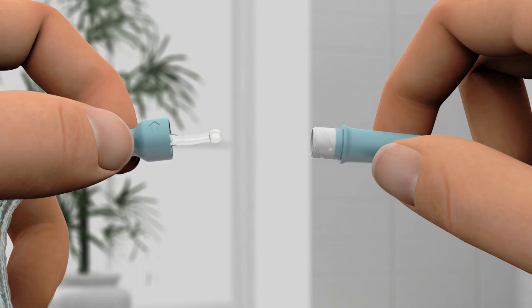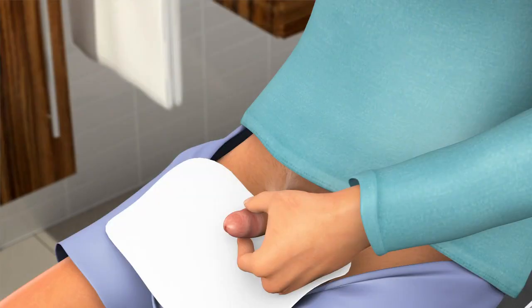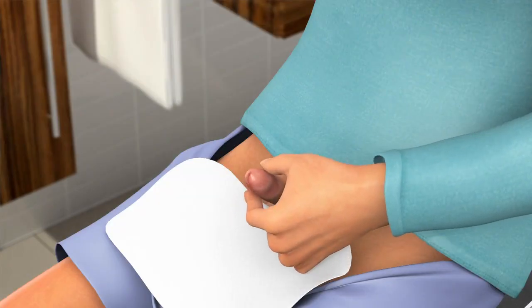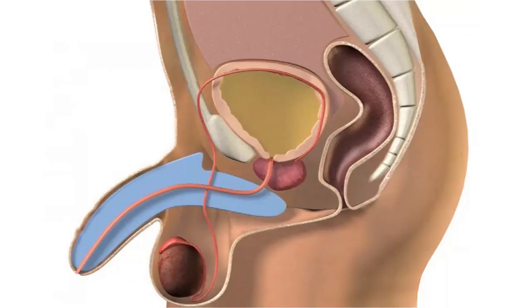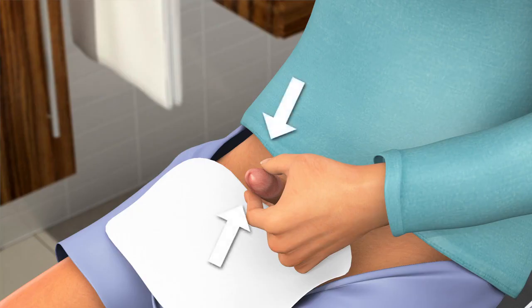If you do not connect to a urine bag, empty the liquid into the toilet. Glide your fingers towards the drainage end to empty the last drops of liquid. Hold your penis pointing upwards and close to your stomach. This will ease the insertion of the catheter, as the natural S shape of the urethra will then change into a U shape. Provide a gentle pressure to the head of your penis in order to open up the urethra, but be careful not to squeeze your penis, as this may obstruct the passage of the catheter during insertion into the urethra. To help insertion of the catheter, it is important that you relax.